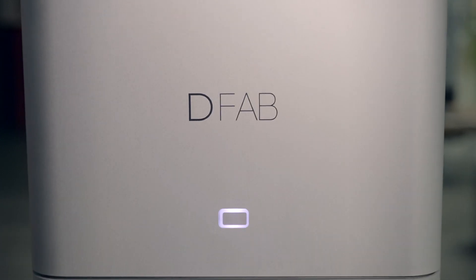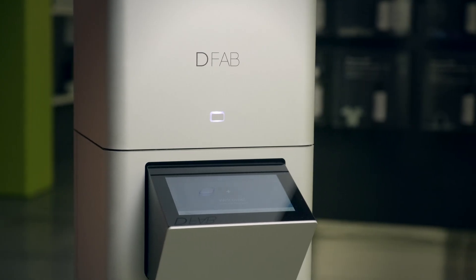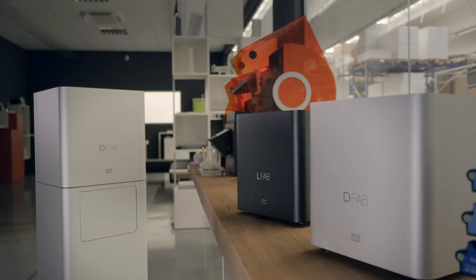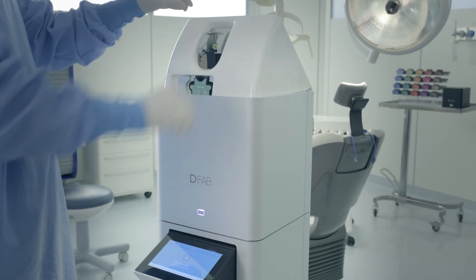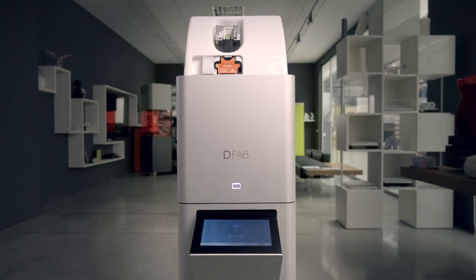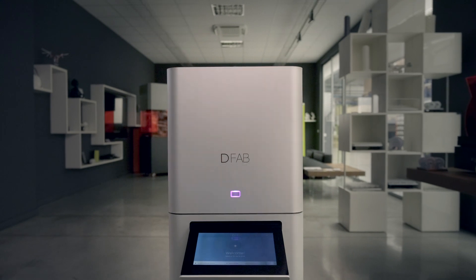Join the DFAB world. Open the doors to the digital dentistry revolution. DFAB, the turning point of the dentistry world, is the result of the long-term experience of DWS at work to meet these needs.